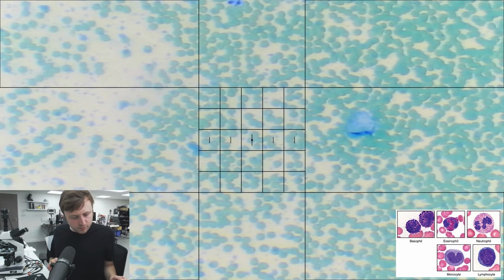So according to the Google AI overview, neutrophils are typically 55 to 70%. Mine here is 38%. That would be categorically lower. The lymphocytes are actually okay in this one. So usually 20 to 40%. This is 36%. So that's smack bang in the central. But again, our differential count is wrong because we have unknown ones. Monocytes are typically 2 to 8%. And that one is again smack bang in the range, which is interesting.